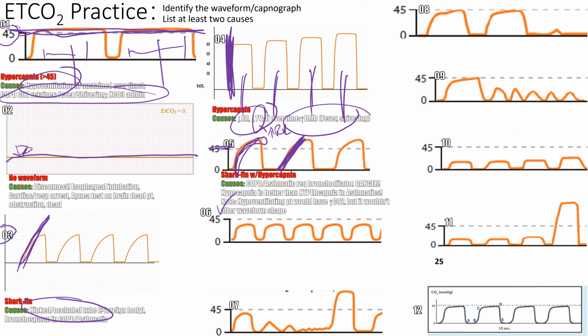So we're just thinking that they're tachypneic? Yeah, it's a fast rate, right? The end tidal CO2 looks normalish. I don't have a low end there, right? Probably that's like 35. So it's normal end tidal CO2, but I keep an eye on it to make sure which direction it's going if they're breathing that fast. Make sure it's not going down or up.